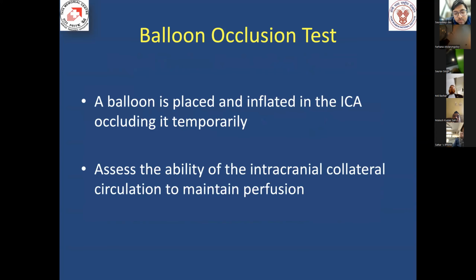Now, moving on to vascular intervention, one of the common vascular interventions we do is a balloon test occlusion. Balloon test occlusion is done for those tumors which are very close to the carotid artery, and where the surgeons feel that there is a risk for carotid injury on table, and they might have to sacrifice the carotid artery in case there's an injury. So any situation which warrants ligation of the carotid artery on table during surgery, we do a BTO.